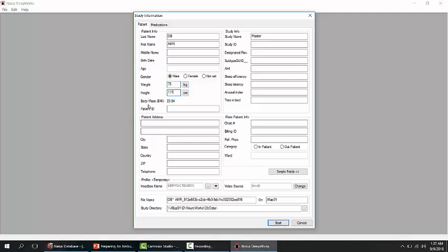Weight and height can be entered in either imperial or metric. Body mass index is automatically calculated. Additional advanced fields about physician, billing ID, etc. are available if needed. The study directory box at the bottom of the patient dialog box shows the directory on the hard drive or server where the patient's information and data are stored.